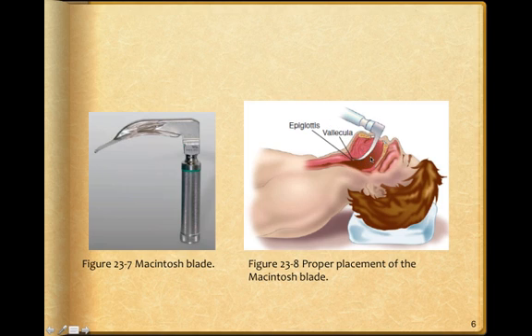Very simply, either get your thyromental angle correct and know the depth that you should be inserting the laryngoscope, or take little small slices out until you see structures that are easily identifiable.